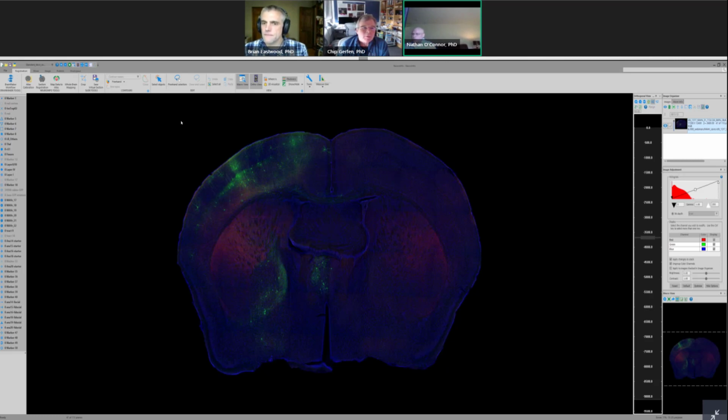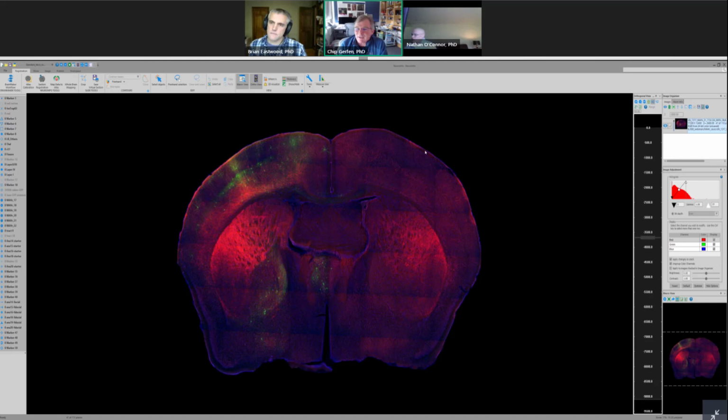What we did was specifically pick areas, even with the pyramidal neurons. People who've done immunohistochemistry know that antibodies sometimes give increased labeling, particularly at the surfaces of the brain. So we went through and picked areas with high amounts of artifactual labeling, and used that as part of the training data, where objects were detected but determined to be not objects, not cells. That's part of the training process: picking artifactual areas where there's a high amount of artifact.